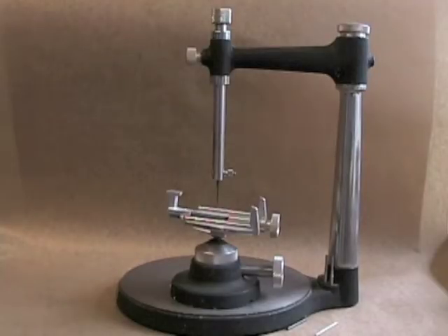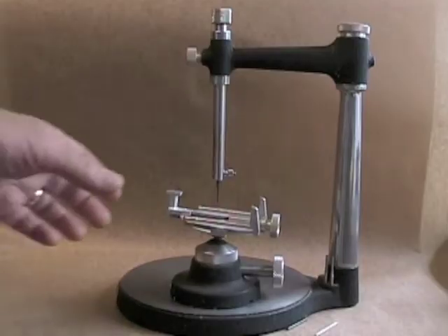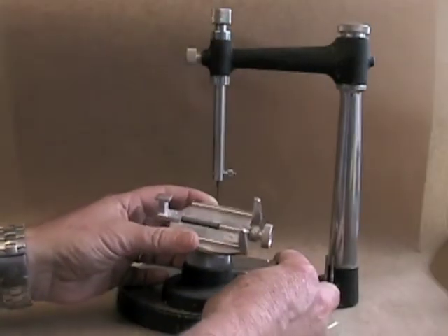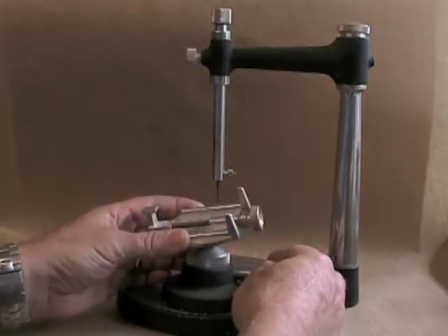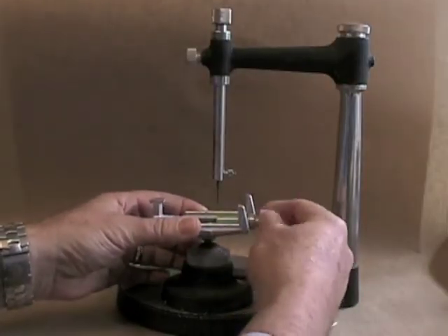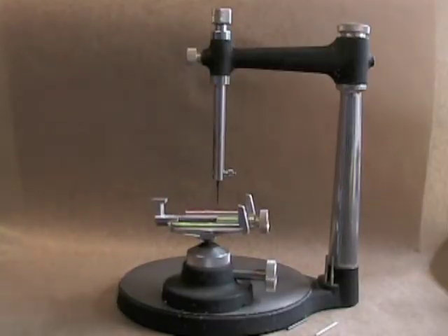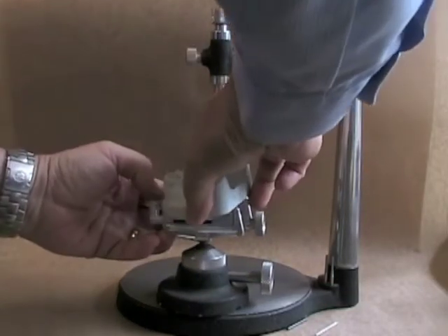This is a dental surveyor, made by Ney — though there are many different manufacturers. The dental surveyor has a cast holder at the base, which has a couple of knobs and allows you to adjust both the tilt of the table and also place a cast in the cast holder for analysis.